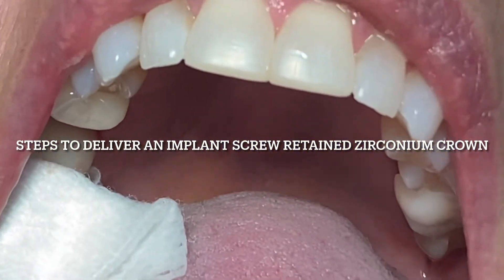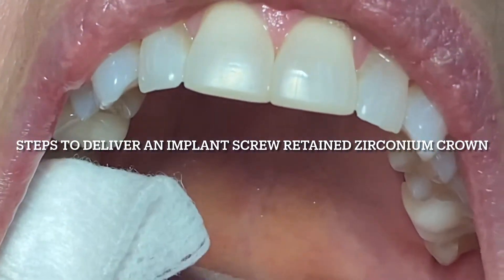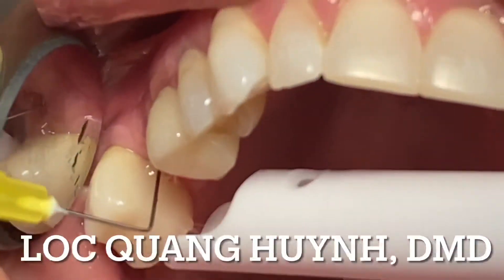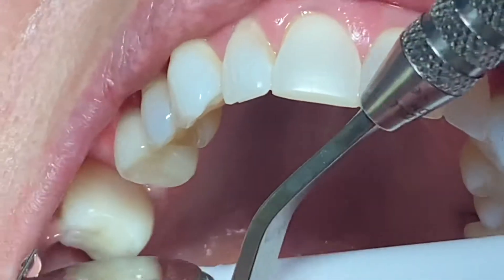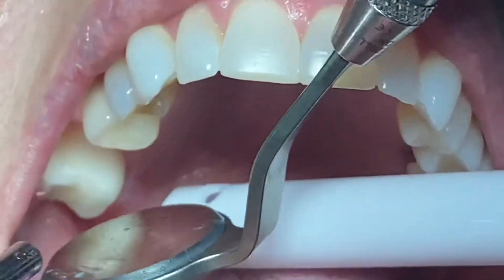As you can see on the occlusal view of tooth number five, I'm using a screwdriver to remove the healing abutment. Now I'm using either chlorhexidine or saline to irrigate the internal part of the implant, making sure there's no debris.